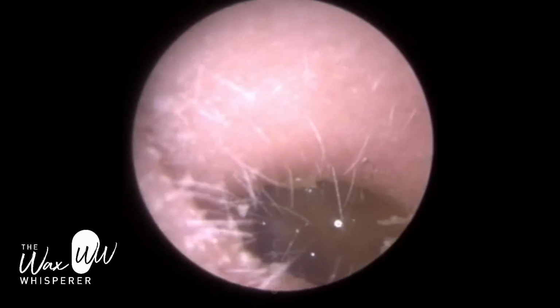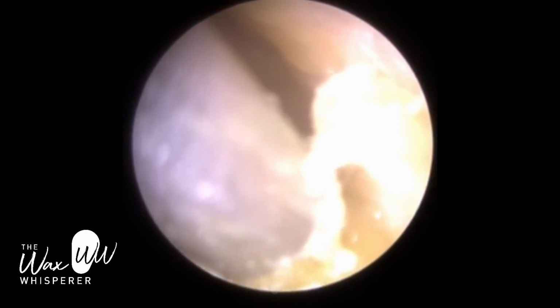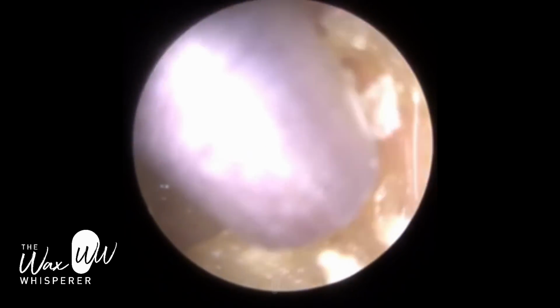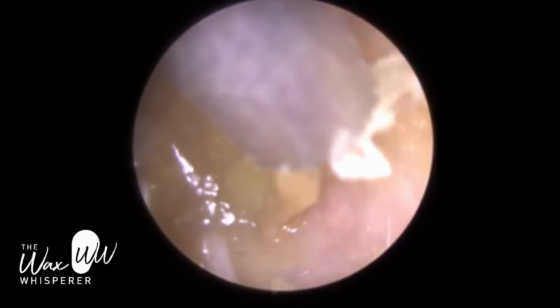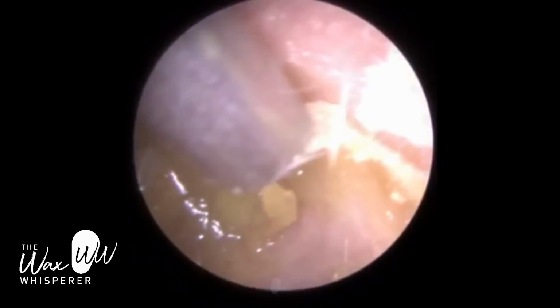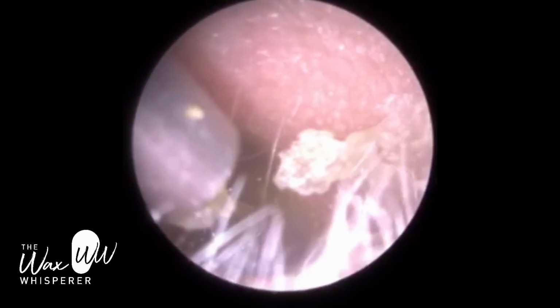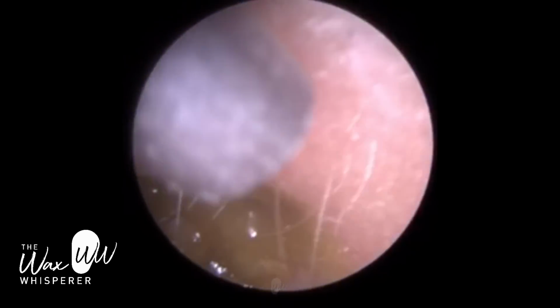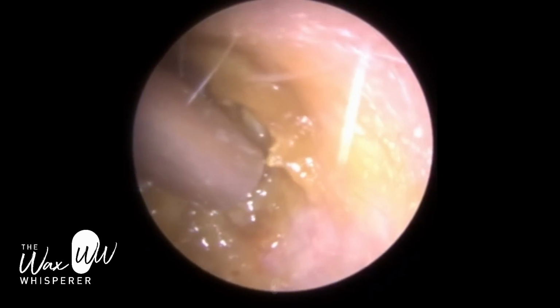It's not ready to be removed, it's still quite thick, and that's just unfortunately excessive use of the drops. The drops have almost dissolved and decomposed this outer layer of skin that's coating the eardrum, and I've got the majority of it out. If we got any more out, it would have been very uncomfortable. We may have perforated the eardrum, which is the last thing we want to do, guys. I got all the soft wax out of the inferior recess and anterior recess so the patient can hear a lot better. We're now on to the patient's right ear, and again, this ear has been overdosed with earwax drops.